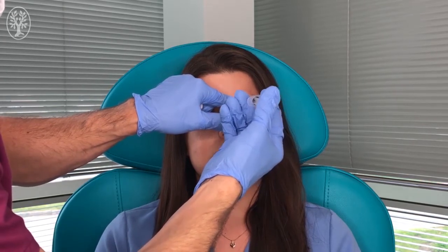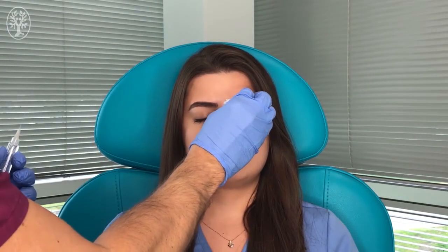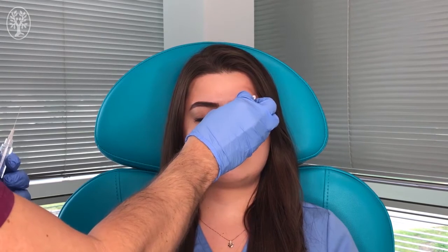After that, we see the wheal and that area is going to start numbing, causing the blocking of the supraorbital nerve in about a minute. This is the supraorbital nerve block.